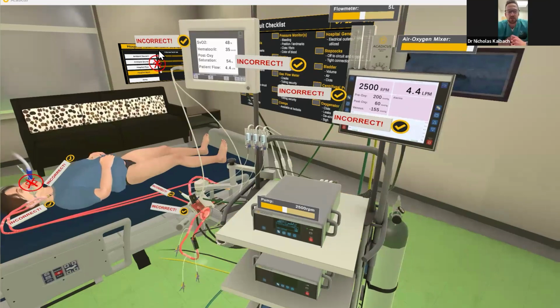And that is what's going to actually interface with the blood over at that diamond-shaped oxygenator. And then you can see we have our oxygen tank, which is always available to us in case we have gas failure. And we also have a spare drive head that's there on that middle shelf.